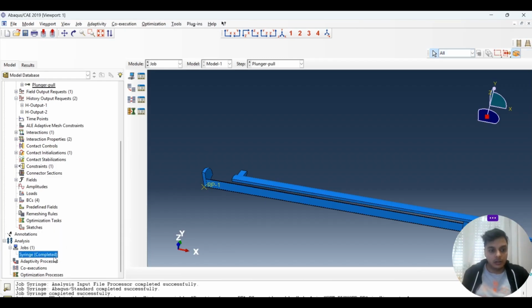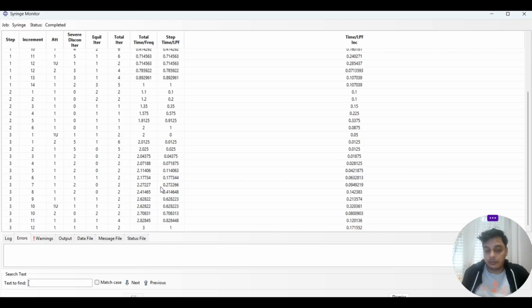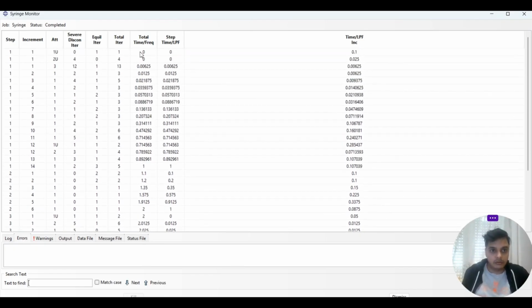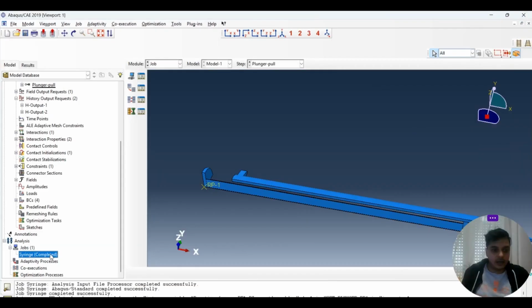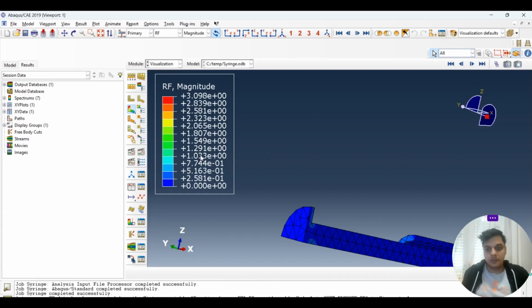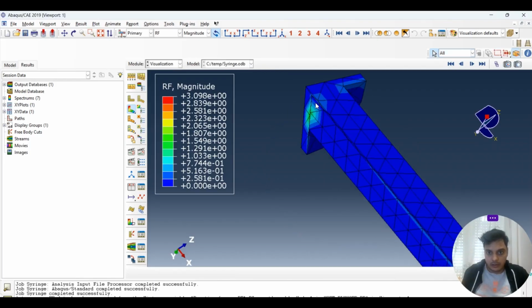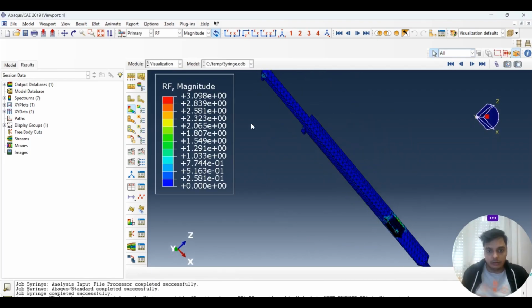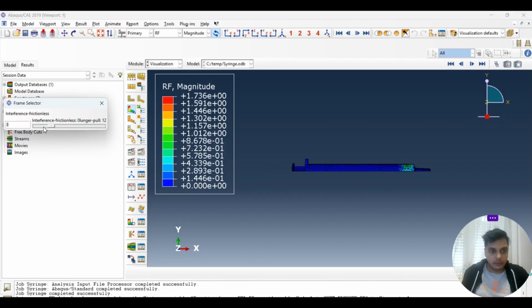We can also check the monitor window for your information. Make sure that three steps are followed. The first step goes from 0 to 1, then another from 1 to 2, then 2 to 3. So in 3 steps the analysis got completed. Also if we check out the results part, we can check the reaction forces, like here we have defined it, and also how it goes on. So it was this part. Initially it was frictionless, then friction comes in, and then the pulling starts.